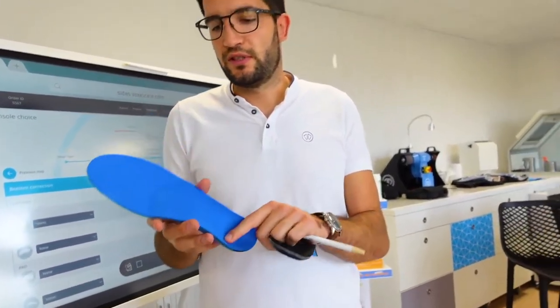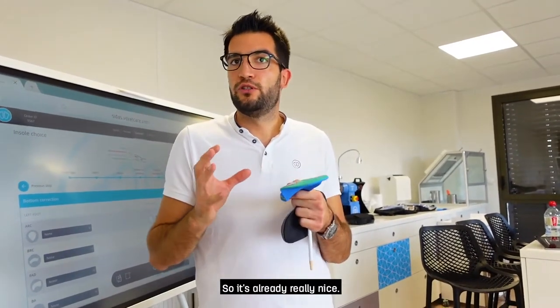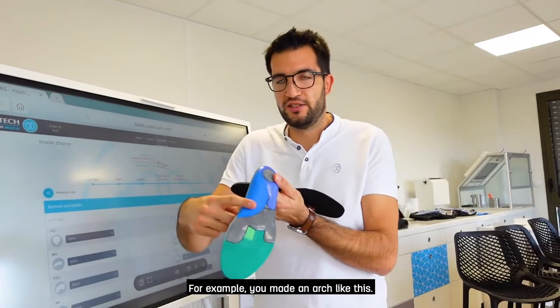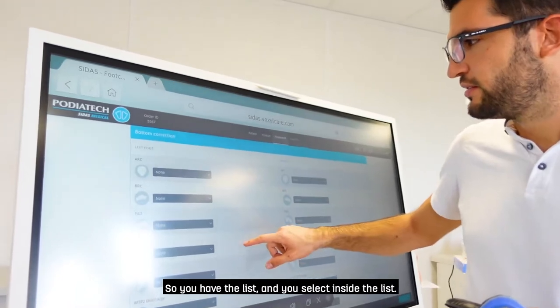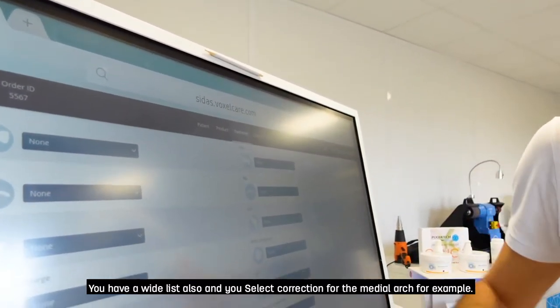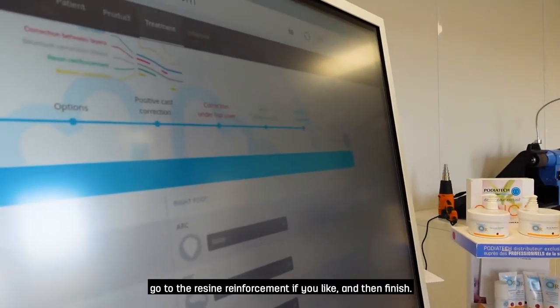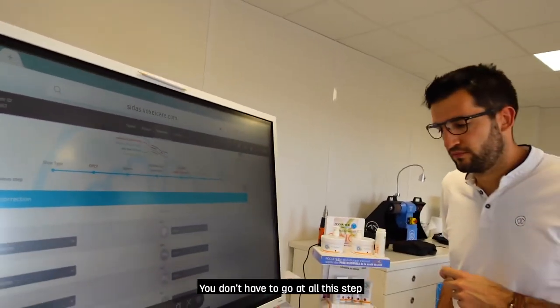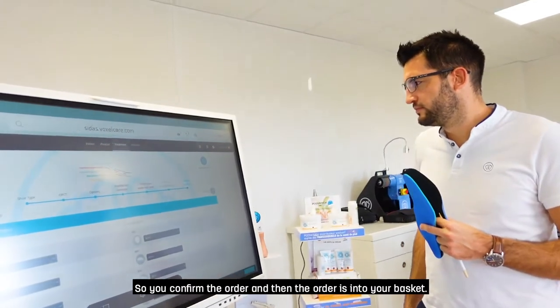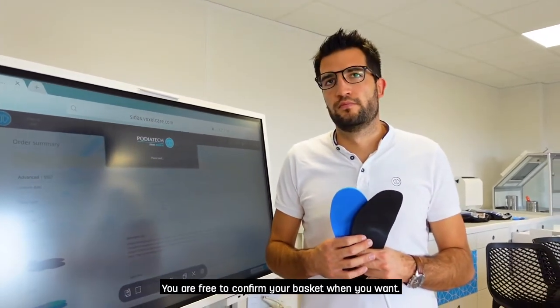The fourth and final category is Bottom Correction. If the previous three steps aren't enough, you can add pieces of materials at the bottom of the insole — for example for arch support. You select from a list for the middle arch. An important note: you don't have to go through every single step. You can just choose your positive cast corrections, go to the resin reinforcement if you like, and then go straight to the end. Now we confirm the order and it goes into your basket — like Amazon. You are free to confirm your basket whenever you want.